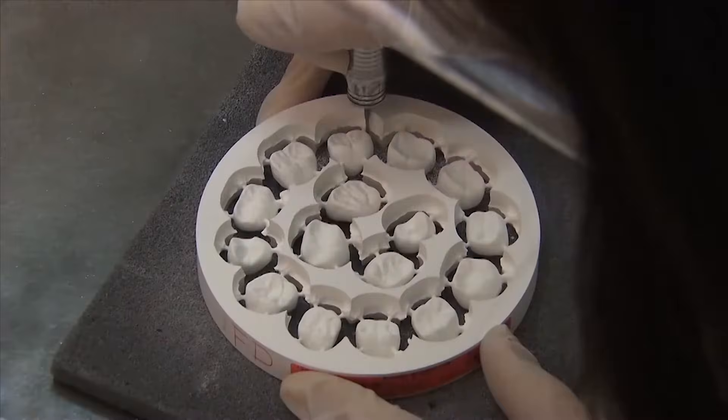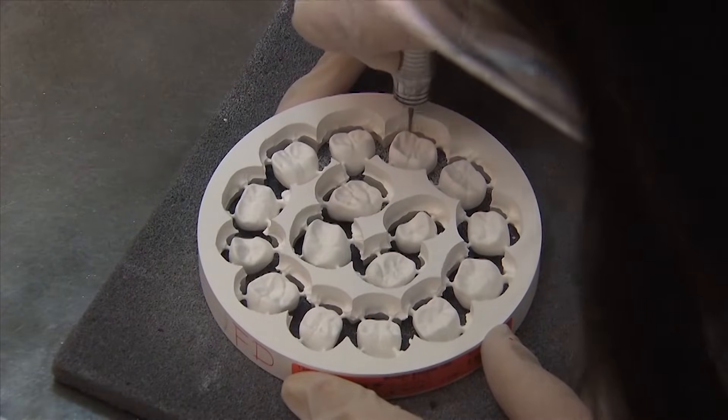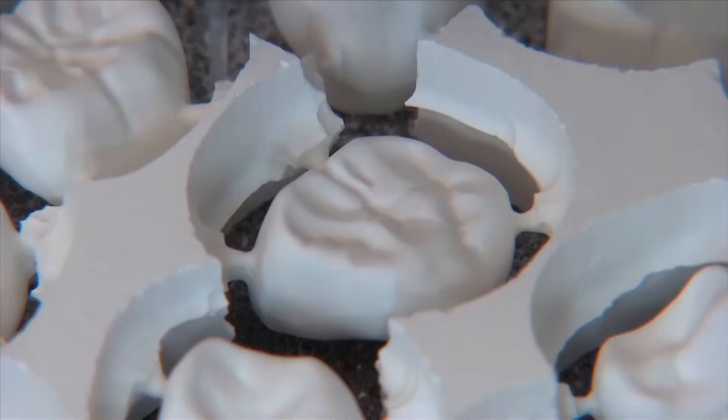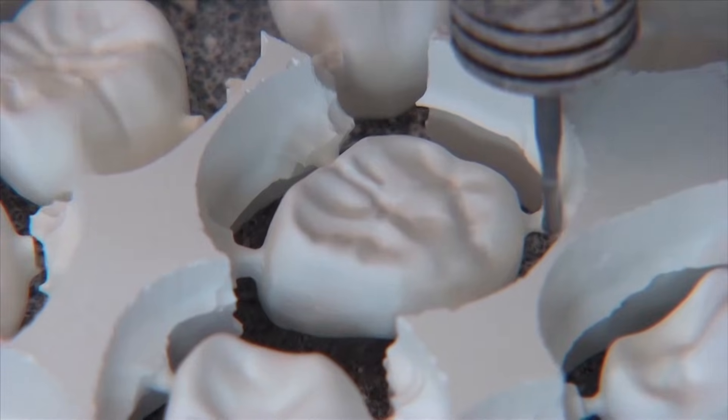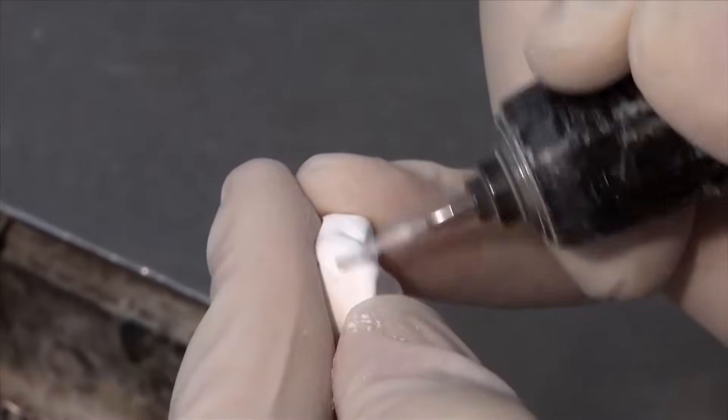They look like veterinary crowns. They don't look like human crowns. And they're going to shrink while they're in the oven. And amazingly, they're going to end up fitting just fine when you go to try them in the mouth.